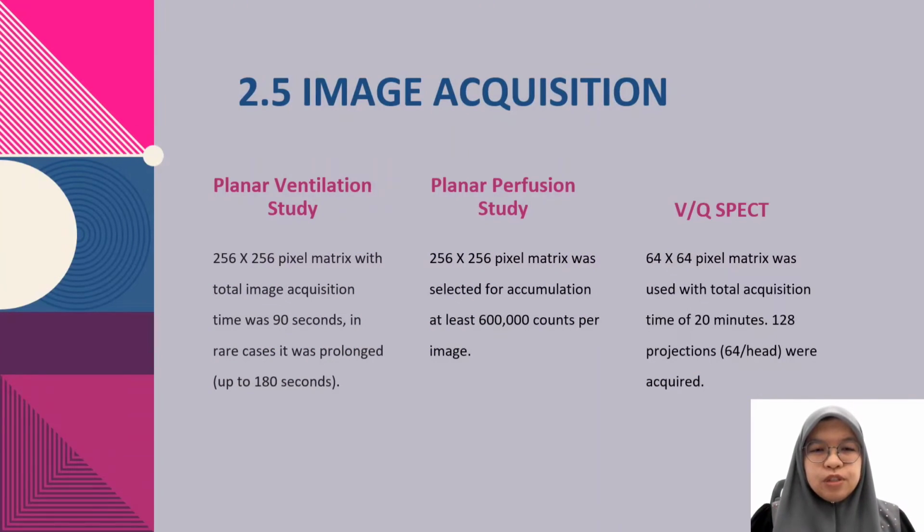Next, I will continue to the next point, which is image acquisition. Image acquisition is the image processing of data collection from the camera. So the image will appear based on acquisition pixel size and time of acquisition.